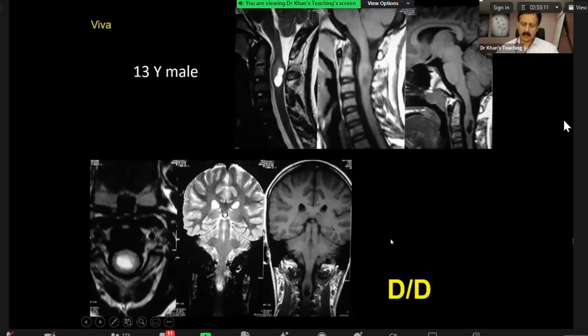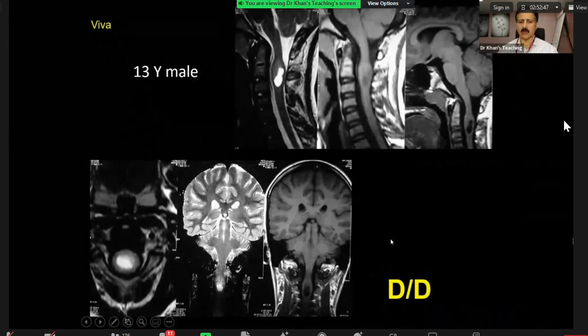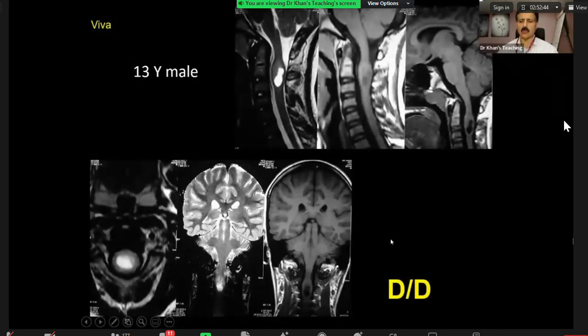Right. So, okay, your general thinking is fine, but a bit of fine touch: my take-home point for you will be that it is good to tell the examiner your thinking, as you have just told me. But ependymoma and astrocytoma will always go together. You are right that in this age group astrocytoma is more common, while ependymoma is more common in the adult population. You are right that hemorrhage goes in favor of ependymoma, but the counter argument is that both of them can occur in each age group.